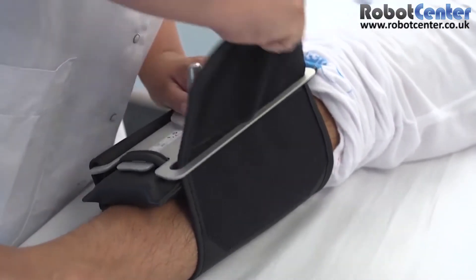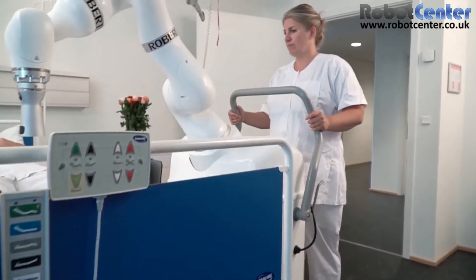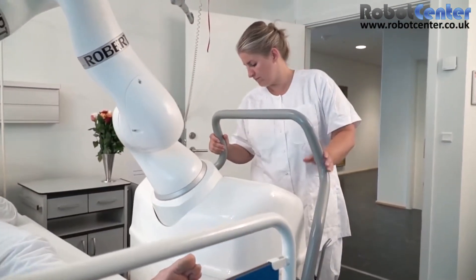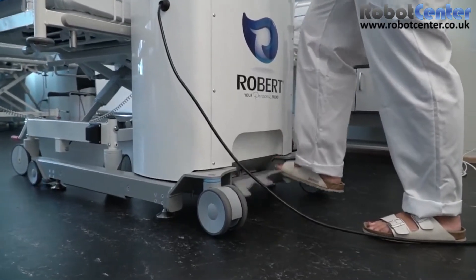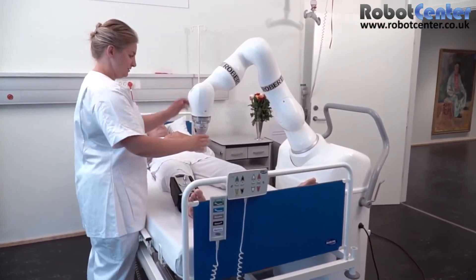A brace will be attached to the patient's lower leg. Then Robert will be rolled up to the bedside and positioned by the patient's legs. The foot brake is activated and Robert will be ready to provide therapy. The therapist directs the robot arm to the brace.